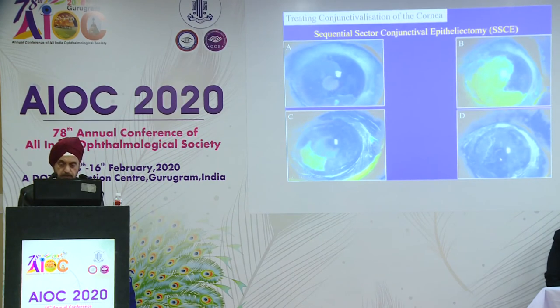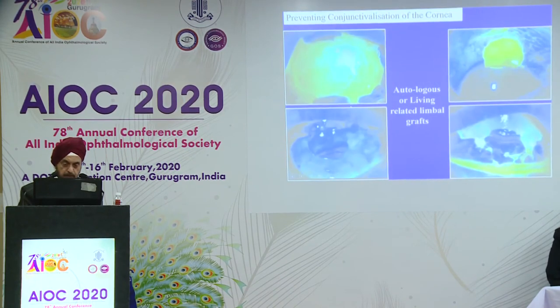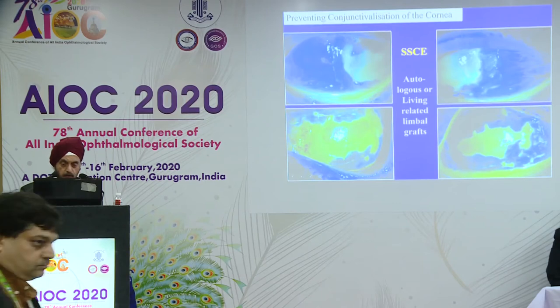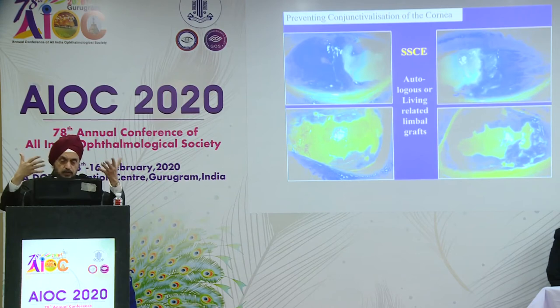But what happens in the situation where you have a living related or autologous limbal transplant? So here what you see is a cement burn, peritomy 360 degrees, clear cornea underneath, two limbal explants, and then from the limbal explant, this is day one, nicely staining, this is the donor site. You can see that cells have started to grow from below and above. But this is the key point. As these cells are growing in, the conjunctiva is also growing in from both sides. And if the conjunctiva comes in, then you have a mixture and you'll have a problem.